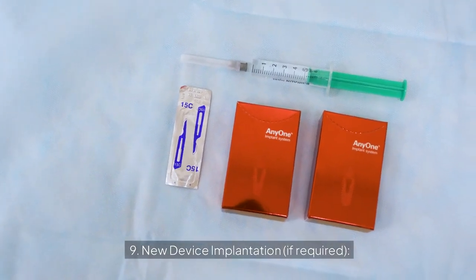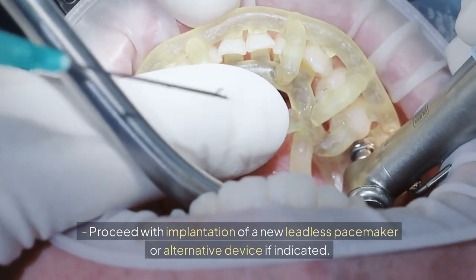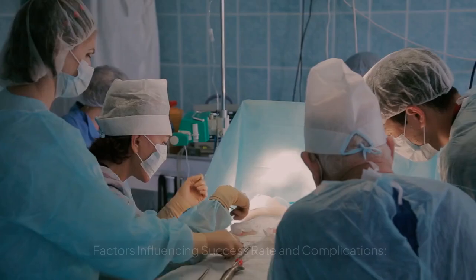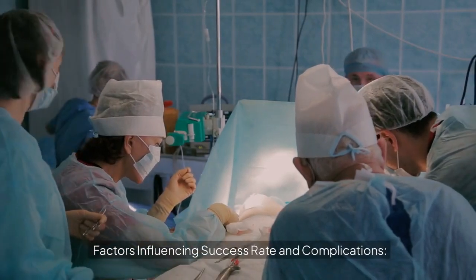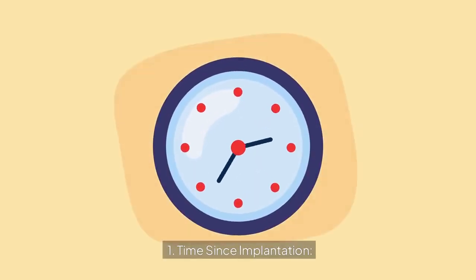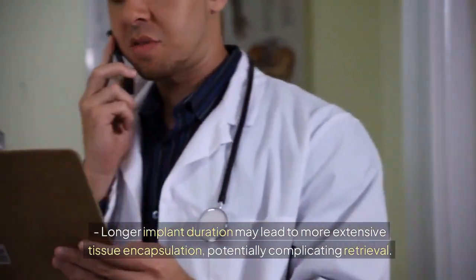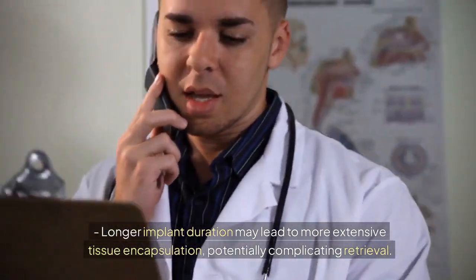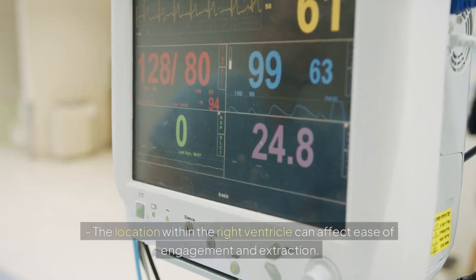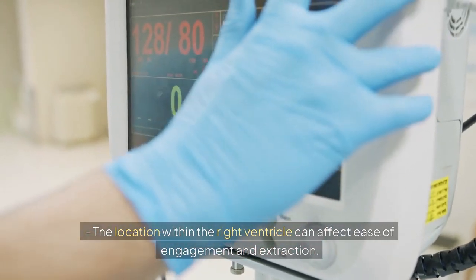9. New device implantation, if required. Proceed with implantation of a new leadless pacemaker or alternative device if indicated. Factors influencing success rate and complications. 1. Time since implantation. Longer implant duration may lead to more extensive tissue encapsulation, potentially complicating retrieval. 2. Device position. The location within the right ventricle can affect ease of engagement and extraction.